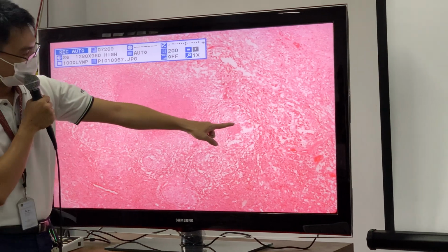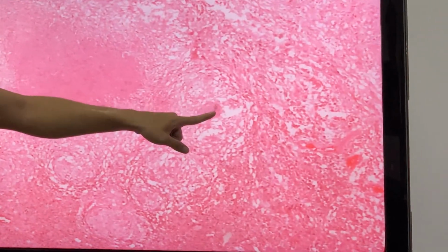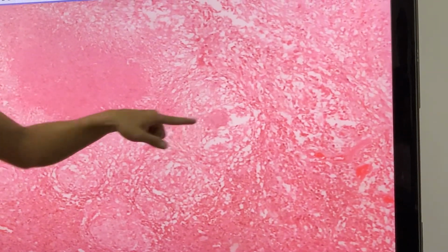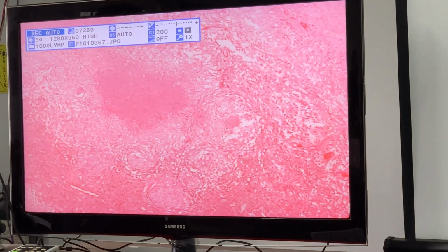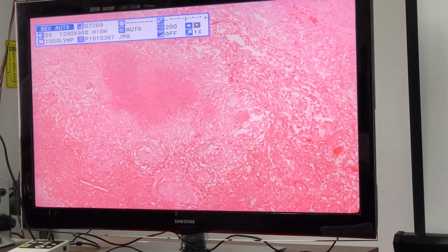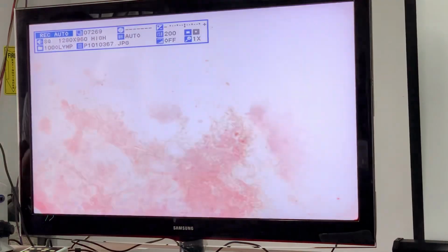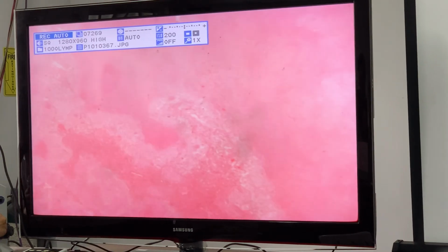The staining is not so good, but you can see there are nuclei in a U shape here. The staining makes it quite hard to see the nuclei. This is the giant cell. The staining is not good. This is an old slide. These slides are way back from 2014. In fact, they've never been used by the pathology department. First time we've been using these.